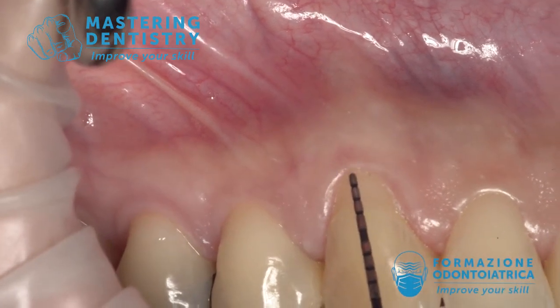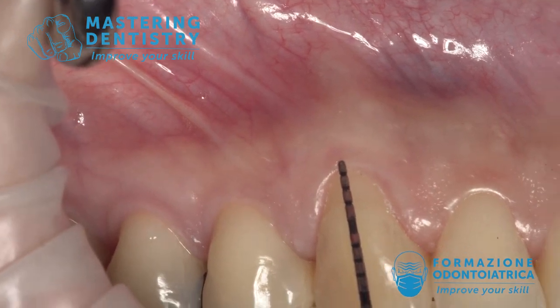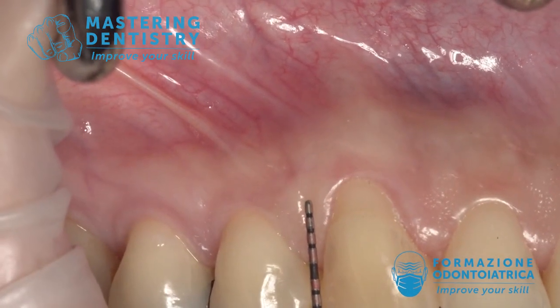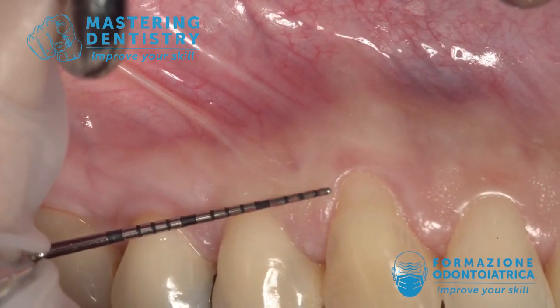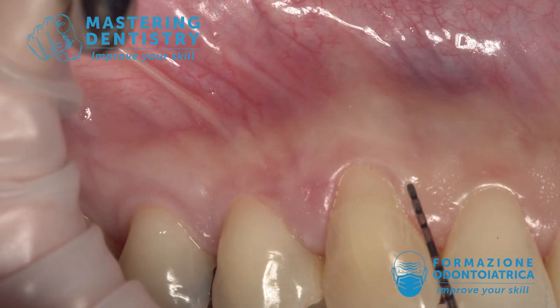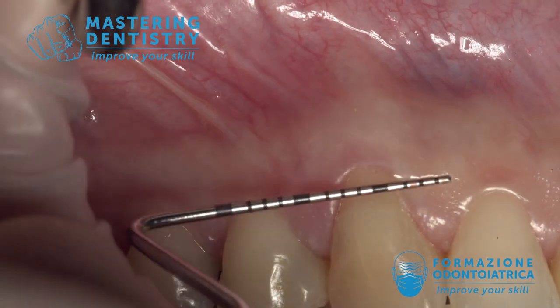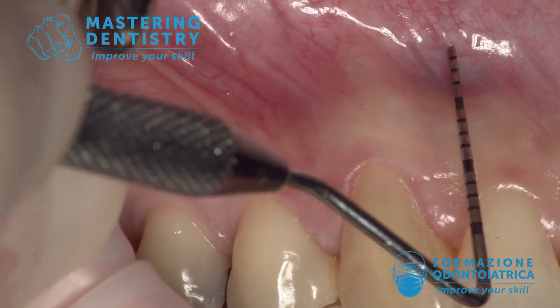Let's see in a real patient what we have already seen in the paper scheme and paper model in the last article. We have to measure the length of the recession, add 1 millimeter and report the measure from the tip of the papilla on one side and the other.